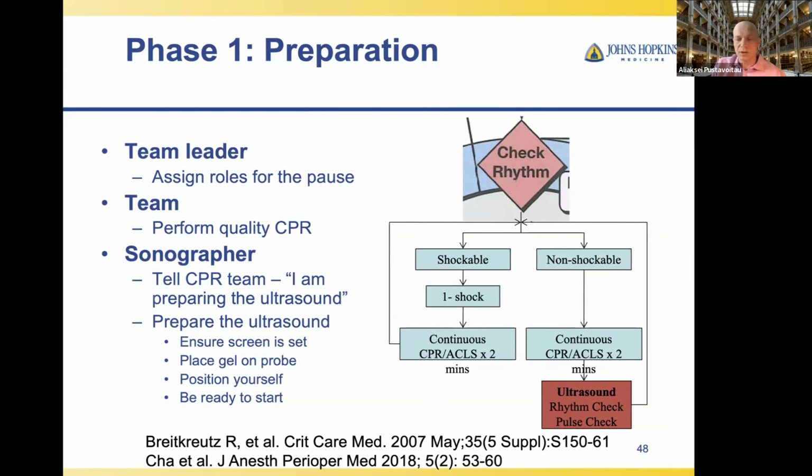Why is that important? Because if you decide to defibrillate or deliver electricity for cardioversion, you can actually create an arc, because gel is water soluble. So instead of defibrillating the person, you can actually create a burn on the skin if you don't wipe off the gel.